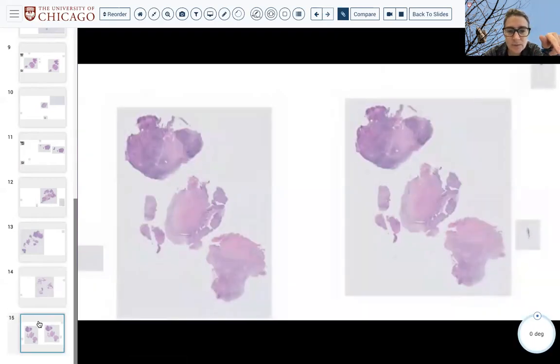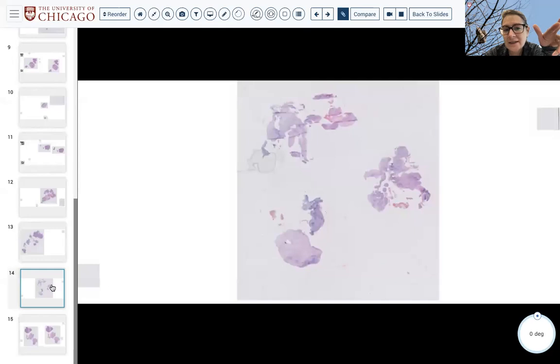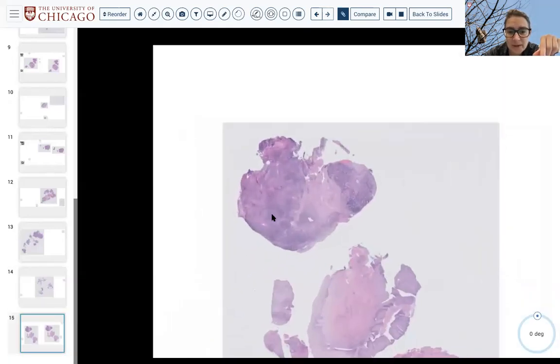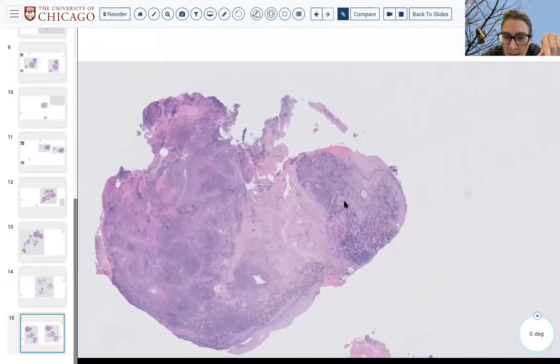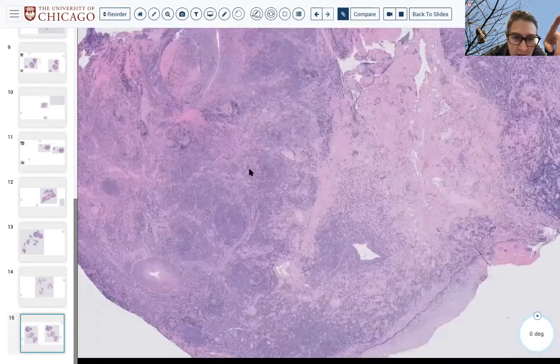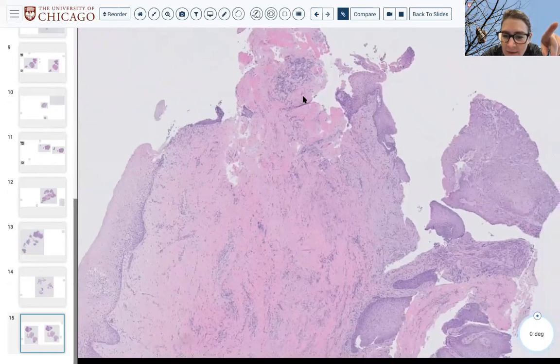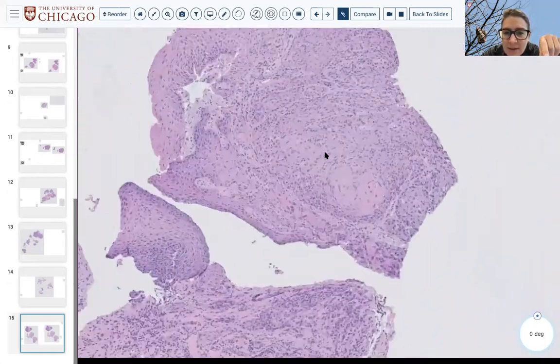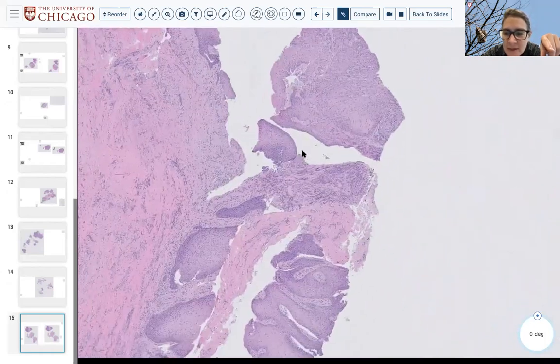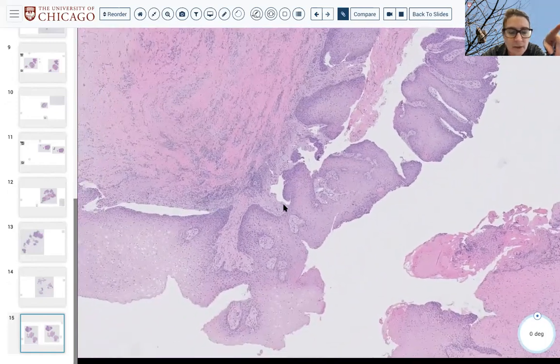And so I've given you the remnant, which arguably has a lot more tissue left that hasn't been faced, but it's okay because you got the carcinoma. You got the carcinoma on your first faced section. I think it was quite hard to see here because it got cut through, but oh, there it is. All right, so here's the carcinoma.